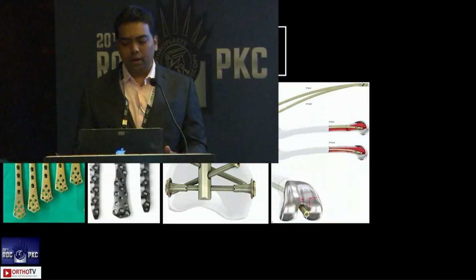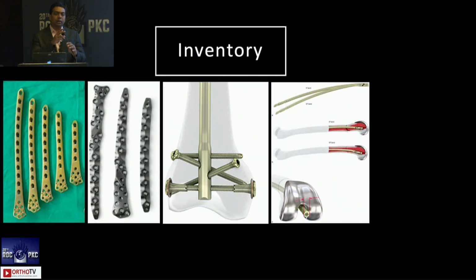I don't think they are available for us right now, because usually when we are fixing these fractures with a distal femur nail, the entry point of the nail through the box is usually more posterior than what we have for a routine distal femoral nail. Therefore, passage of a normal or standard distal femoral nail will actually displace the fracture. It is not going to keep the fracture reduced there. Therefore, if we try to put a normal distal femur nail through a prosthesis, it's not a good idea.